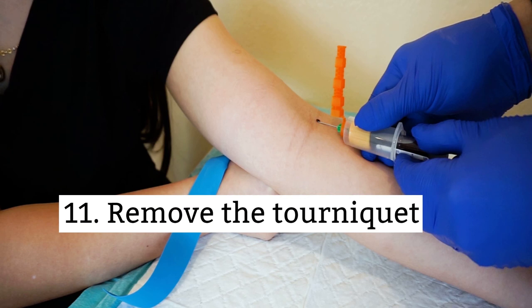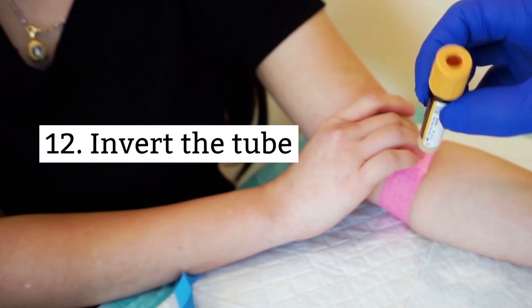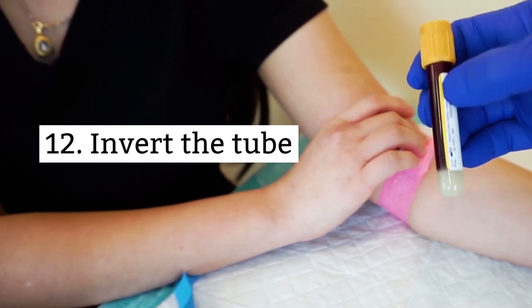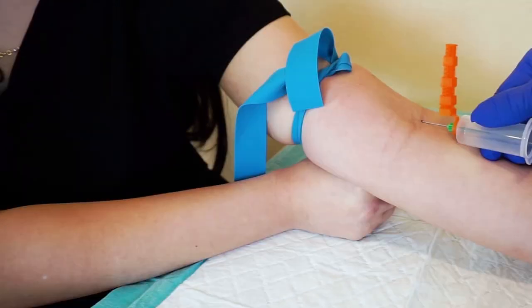Eleventh, as the blood is flowing, let the tourniquet go. Leaving the tourniquet on too long will cause hemoconcentration and that will interfere with the test results. Twelfth, remove, then gently invert the filled tube a few times to prevent blood clots. And I said gently because you do not want to cause the blood to hemolyze.